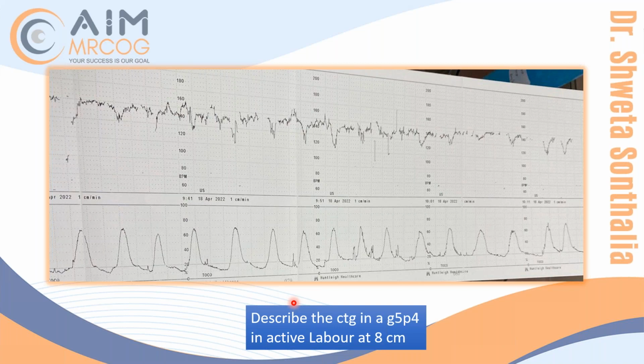Yes. I also might label it as early, but then again, it is different in size and shape, so it is not fitting into early. Variable deceleration. So that's what I'm telling. When I put this to my study group, when we were doing CTG questions, I used to send them from labor ward whenever I'm on labor ward duty to the students. I sent it to the students thinking that it is early, but then students told me, Madam, it is variable. So sometimes everybody can get confused that it looks like early, but actually it is variable. Then I realized, yes, you're right. The shapes are different. The size is different.